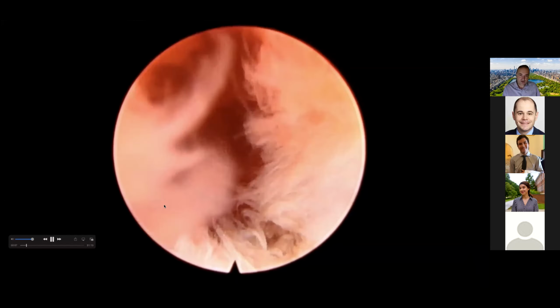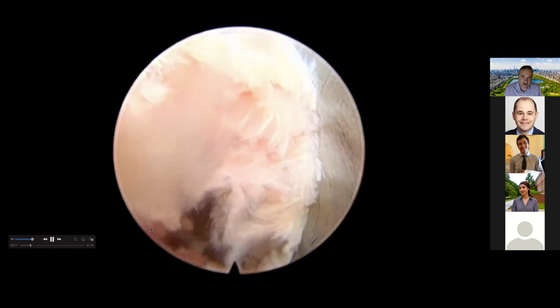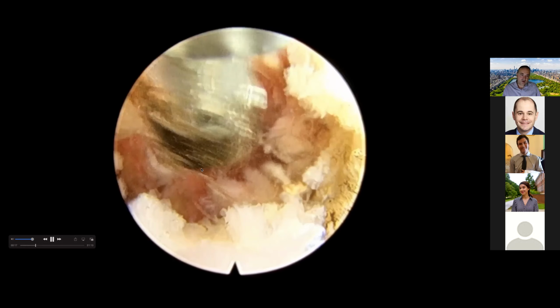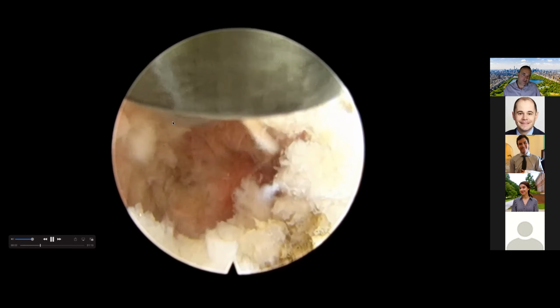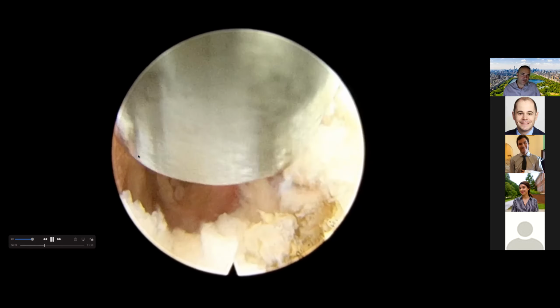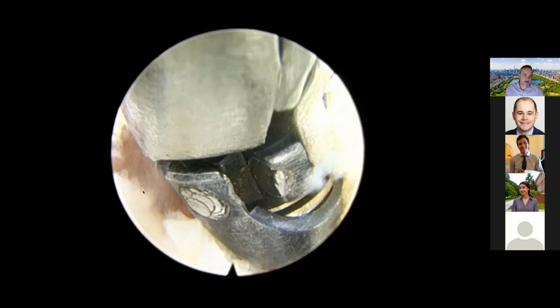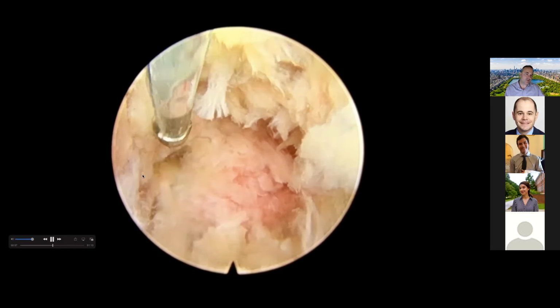What I would like to show you is over here, right inside the disc space, where we have removed most of the disc. You can see this cotton-like material is basically the nucleus pulposus. And over here, we're using the cautery to shrink that disc material. Now we're using the drill bit, and we're drilling off the cartilage from the end plate. When we're doing interbody fusion, we want to expose the bone, and you can see here's the bone that is a little bit bleeding. That's what we want to see, a little bit of bleeding bone.